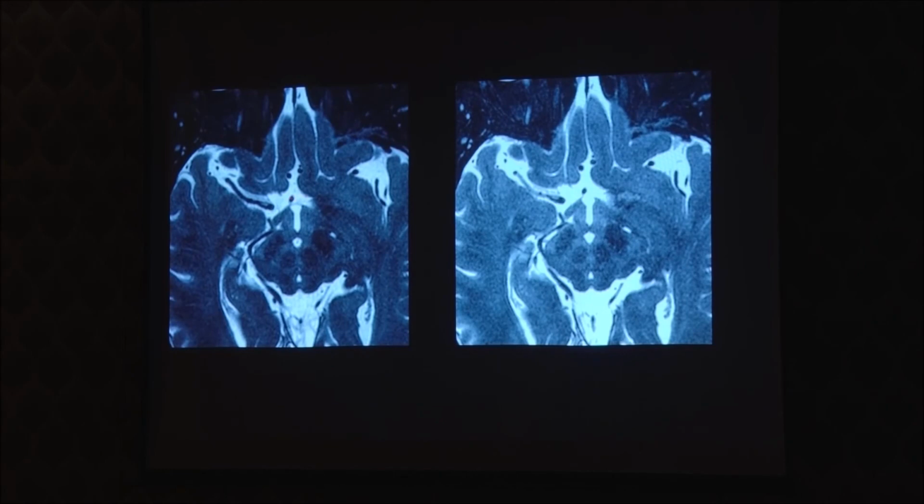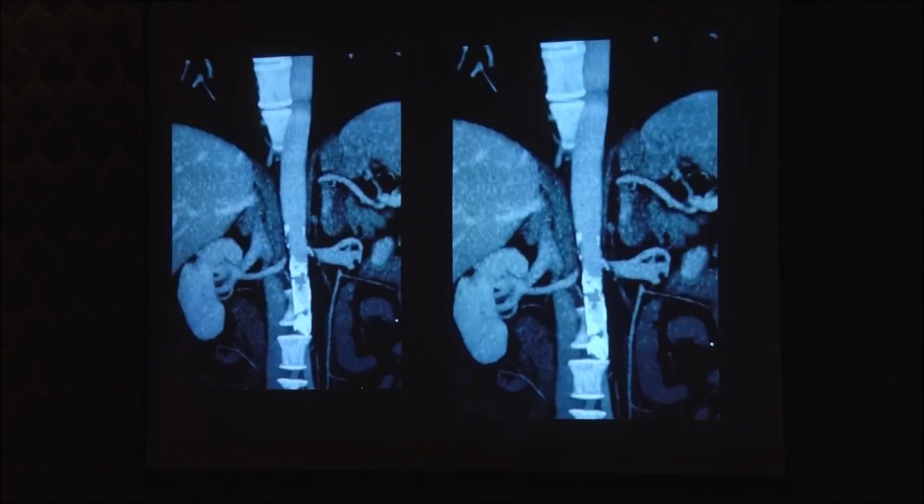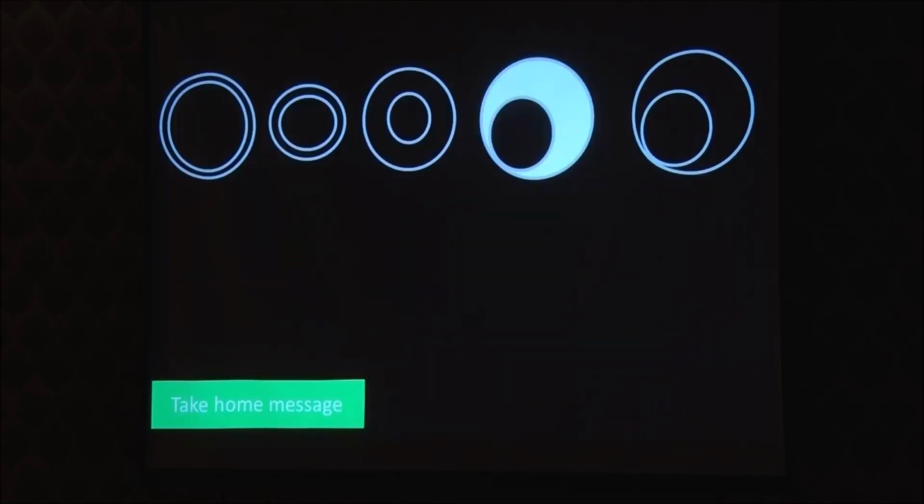And if you see the T2 imaging, what do we see here? It's a beautiful fibrous cap seen there, juxtaluminal, and therefore it is an atherosclerotic lesion. And if you see the CT angiography, there's extensive calcification infrarenal, nothing involving the aortic arch at all. So we know this is atherosclerotic disease. We went ahead and stented this patient.